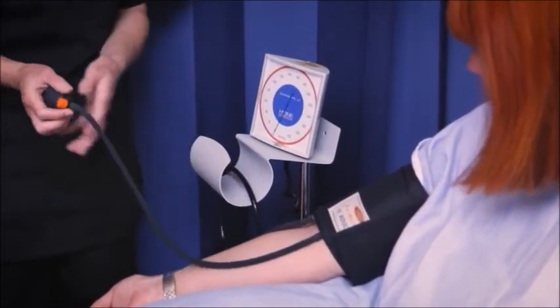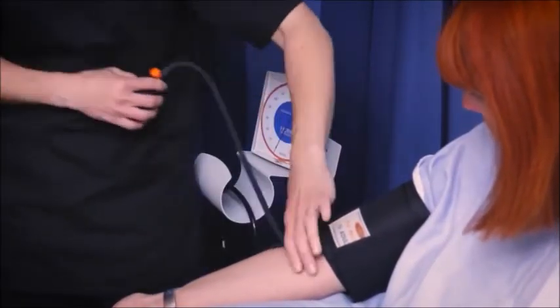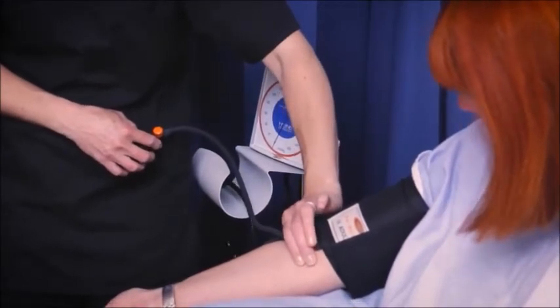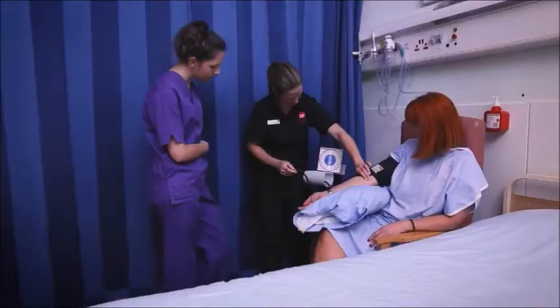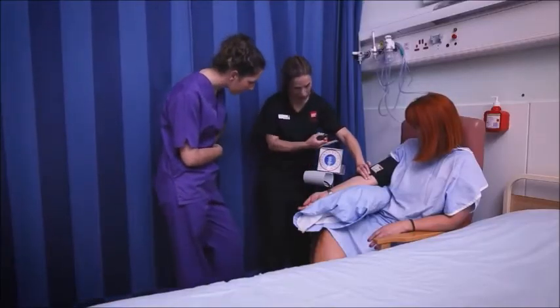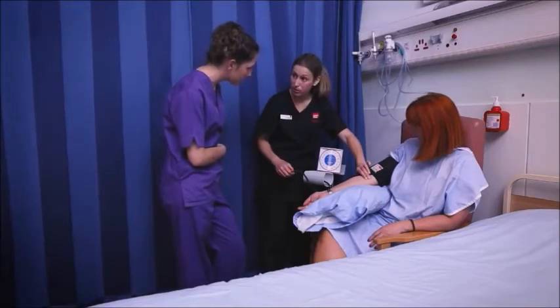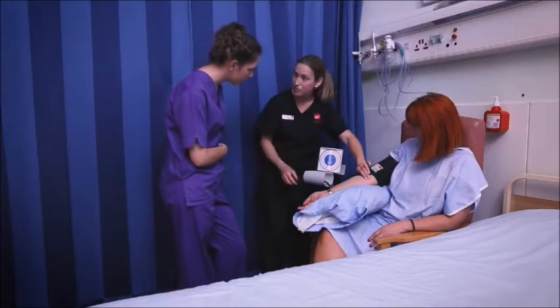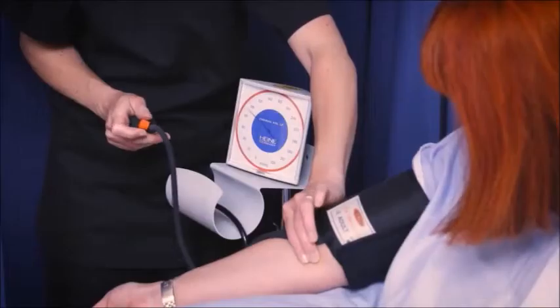So the first step is we're going to need to close off the valve here. And what I'm going to do is palpate the brachial artery like we did before. And what I'm going to do is pump up the cuff until I can no longer feel the pulse. And when I can no longer feel the pulse, I'm going to make a rough estimate of the reading at that point.